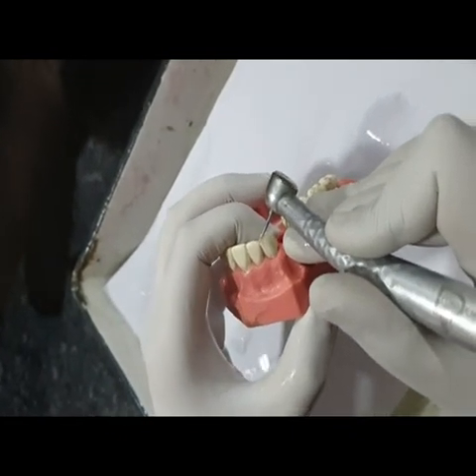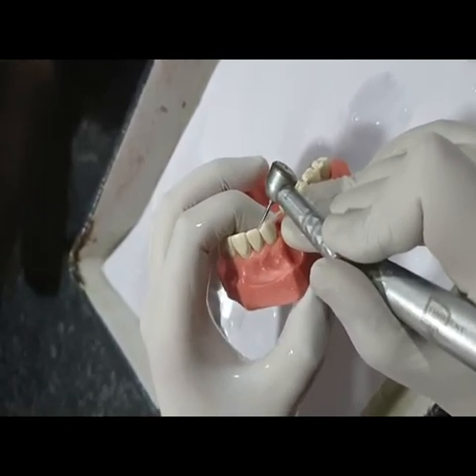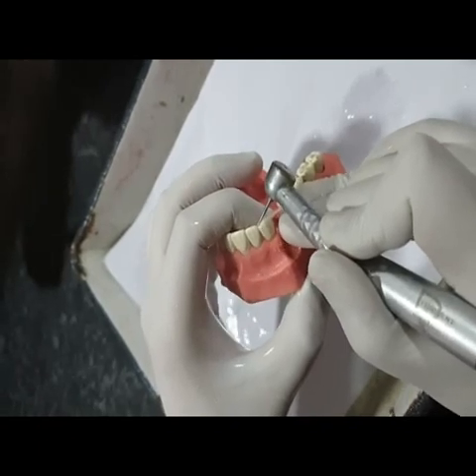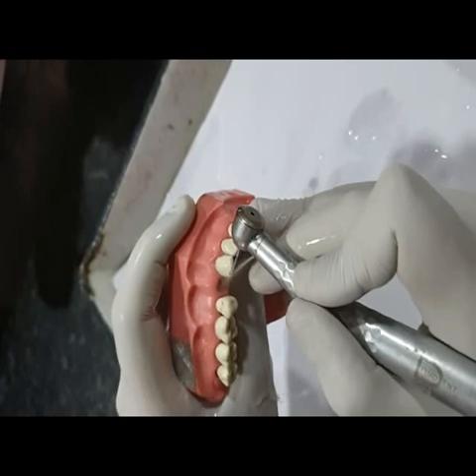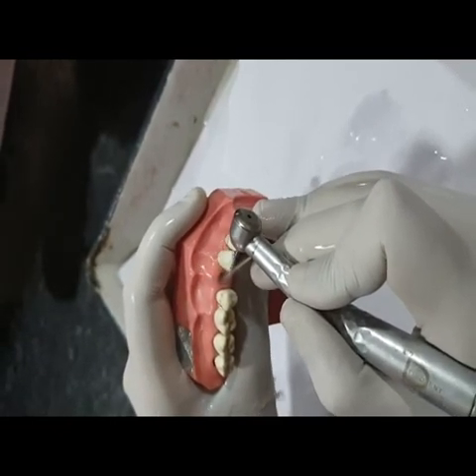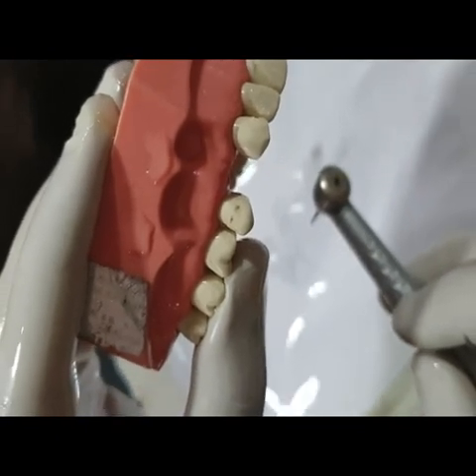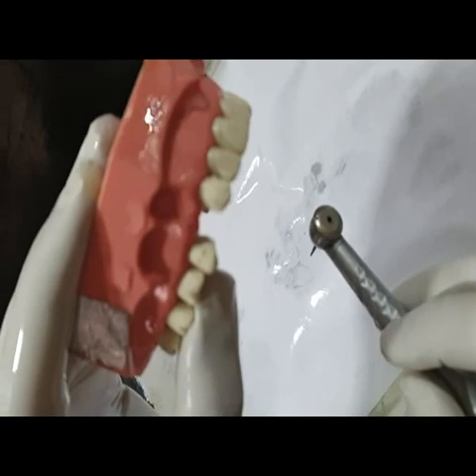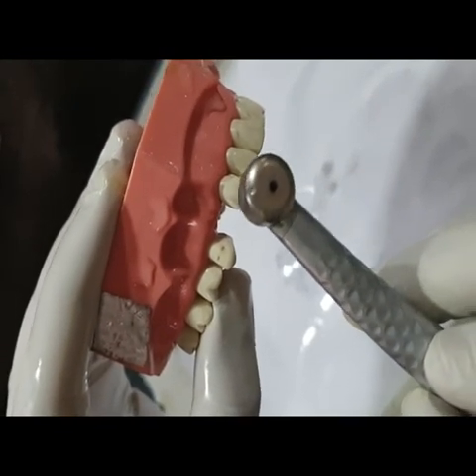After giving the depth orientation grooves, we do reduction of the incisal edge in two planes: one is the mesial slope and the second is the distal slope of the incisal edge of the maxillary canine. Now after I have flattened the incisal edges in two parts — mesial and distal slopes — you can see that we have got the incisal edge reduced in the same manner as present in the natural tooth. You can see a mesial slope which is slightly smaller in length in comparison to the distal slope.